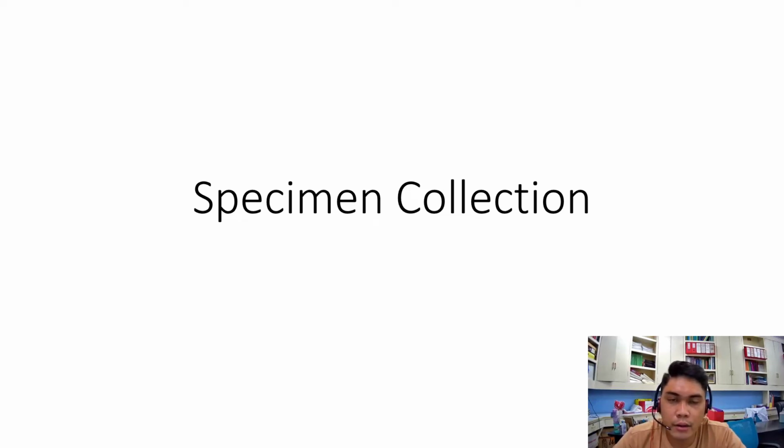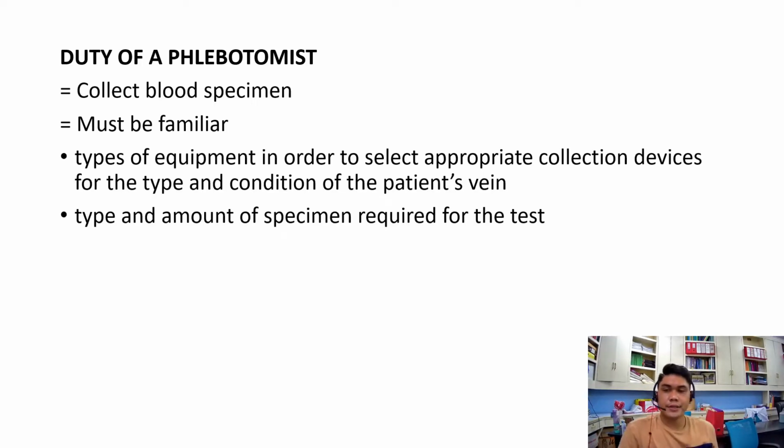So today we'll talk about specimen collection. Okay, so let's start our discussion regarding specimen collection. Okay, so first is the duty of a phlebotomist. So the first duty of a phlebotomist is to collect blood specimen. Okay, so that's the first duty of a phlebotomist, to collect specimen.